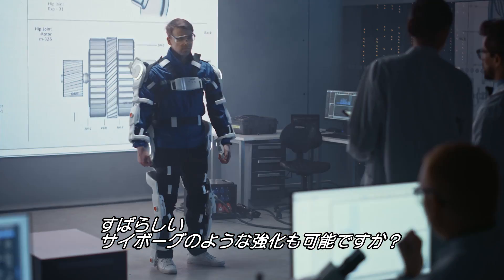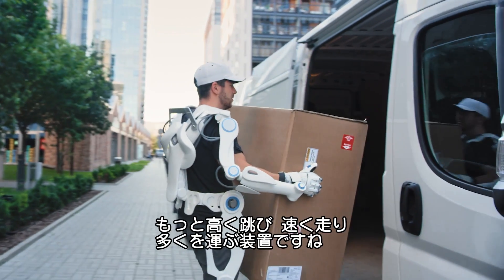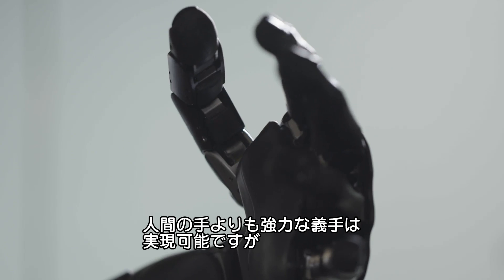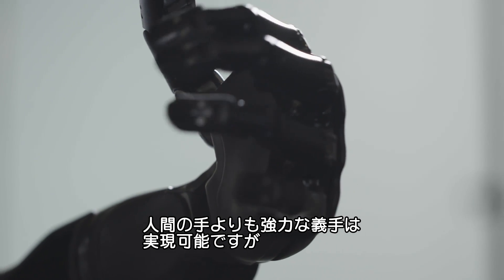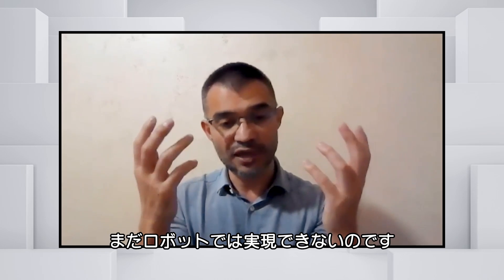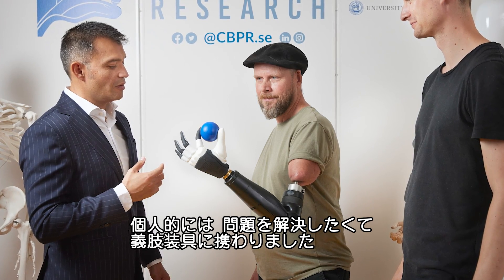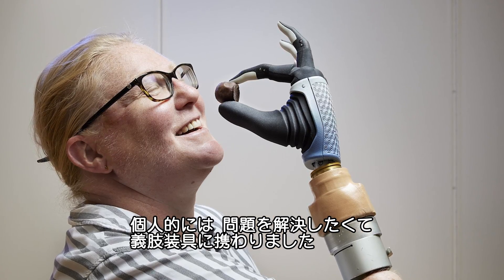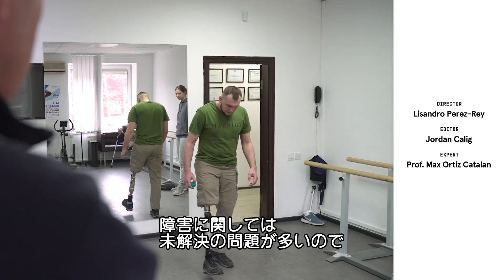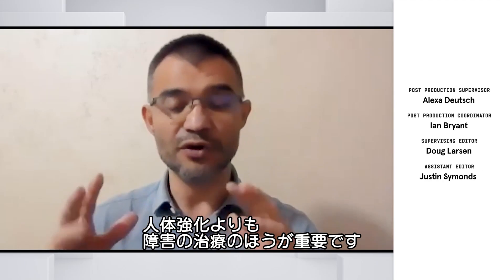Can we make humans stronger, cyborg-style? There will be companies thinking about human augmentation — making humans jump higher, run faster, carry heavier loads. You can have a prosthesis that's much stronger than a human hand, but you cannot yet make one as dexterous as a human hand — that hasn't been achieved from the robotic side. Personally, Dr. Ortiz Catalan got involved in prosthetics to solve problems, and feels it's more important to focus on disabilities that remain unsolved.